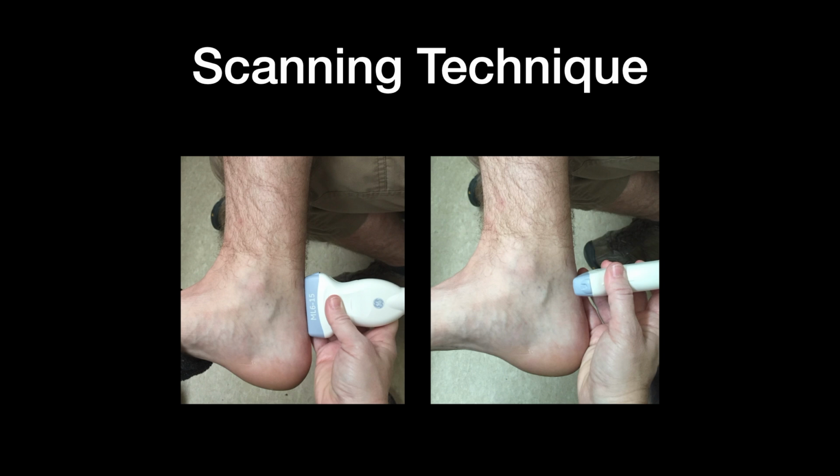And I think I've seen enough things over the years with ultrasound and with other forms of radiography, particularly x-rays, where if you look at it in one plane, it looks a certain way, and when you look at it in another plane, it changes things just a touch, where you can see the orientation, both the x, y, and z axis. And so as you're scanning the soft tissue, you definitely want to scan in the long axis, and you want to scan in the short axis. You can call it sagittal, transverse, long and short, whatever you want, but you want to scan in those two different axes to get a full representation of what's going on with this particular structure that you're scanning, right?